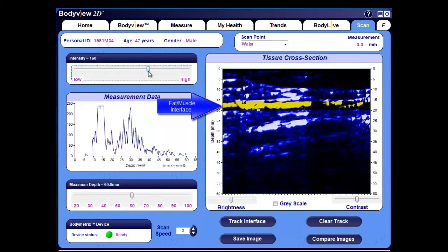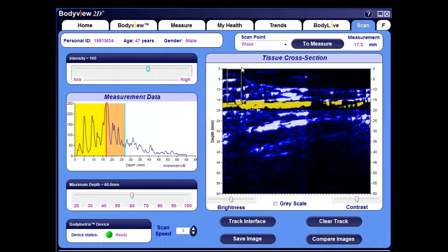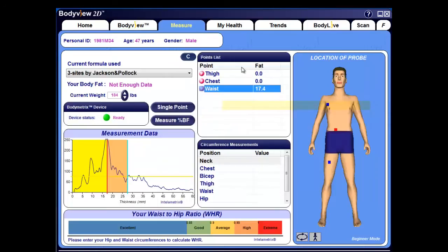Note that if we drag a small rectangle from the center of this fat muscle interface to the top of the image, the total fat thickness, or subcutaneous fat, is measured automatically and displayed here. Note that this coincides with the original site point measurement we took earlier, at 17.4 millimeters.